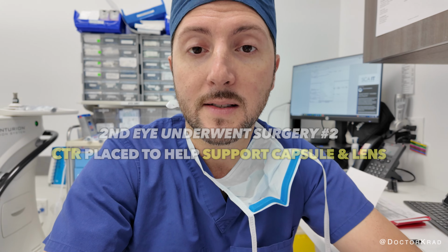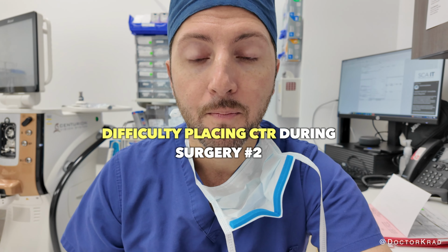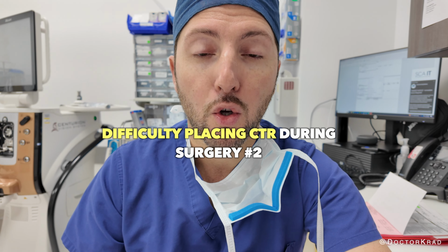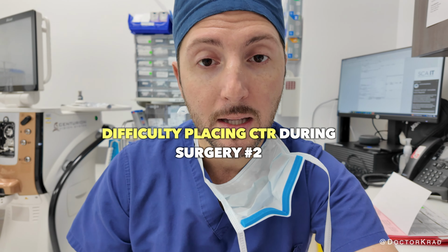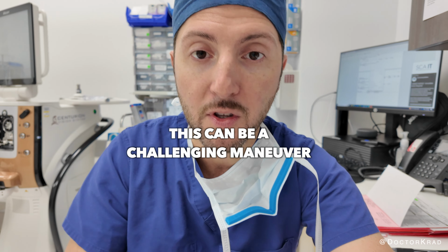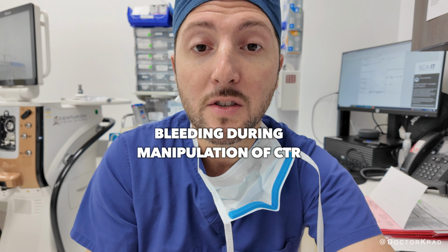However, during the CTR implantation, the doctor encountered a challenge where he thought that the CTR could be partially in the bag and partially in the anterior chamber. And so he had to grab the CTR from the anterior chamber and try to position it posteriorly where it should be in the bag. And during that maneuver, the patient started bleeding, which took away visibility.